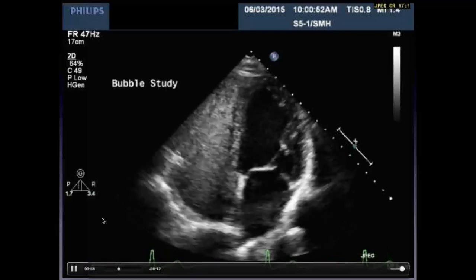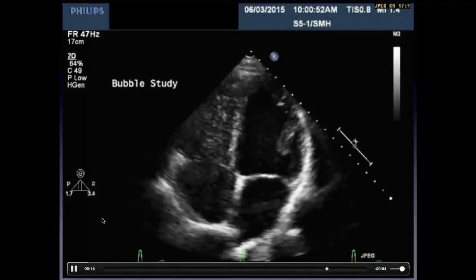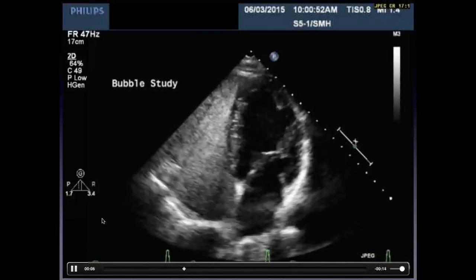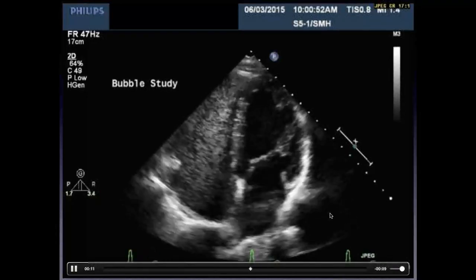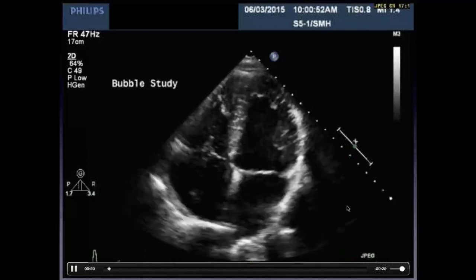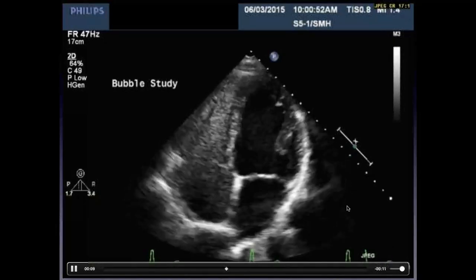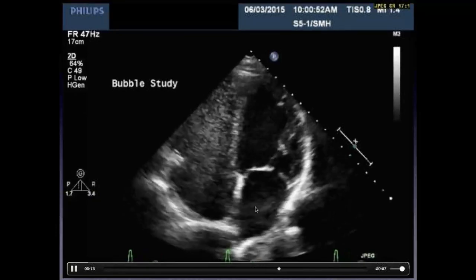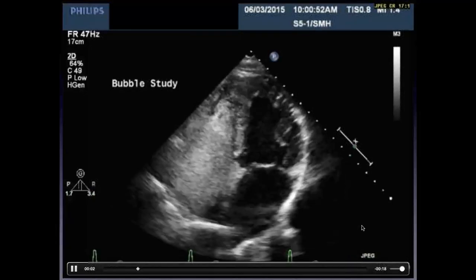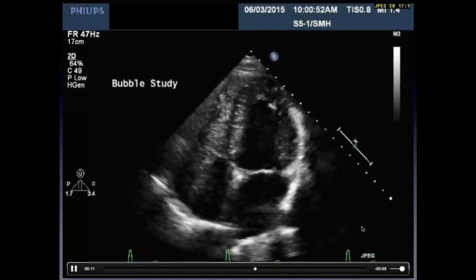Here's an agitated saline contrast or bubble study. You want to see good homogeneous and fairly bright opacification of the right heart structures, then follow any appearance of bubbles in the left heart — ideally long enough that opacification in the right heart has already dissipated. This is a negative agitated saline contrast study. Sometimes you'll be fooled by bright chords flipping back and forth. If you only see structures in the left ventricle and nothing in the left atrium, be concerned you're picking up bright artifacts on chords. Ideally a positive study should show bubbles going into the left atrium and then the left ventricle.